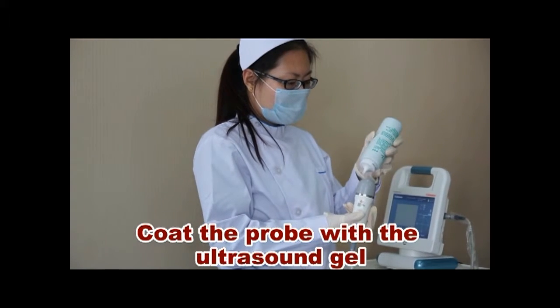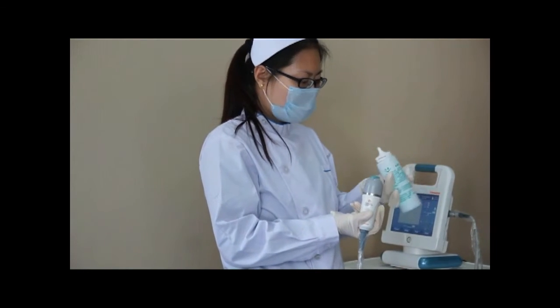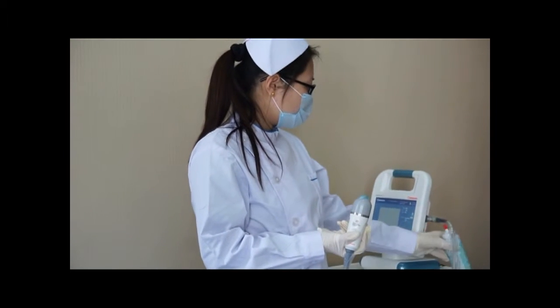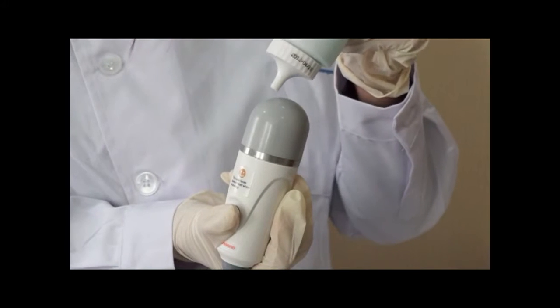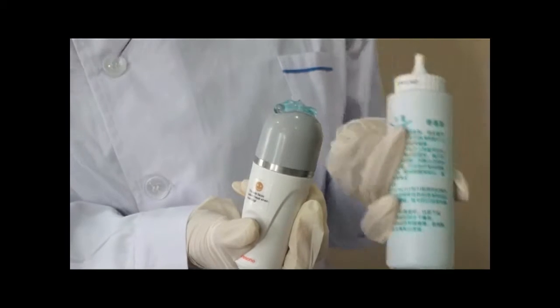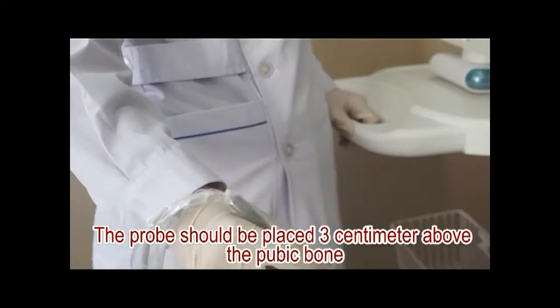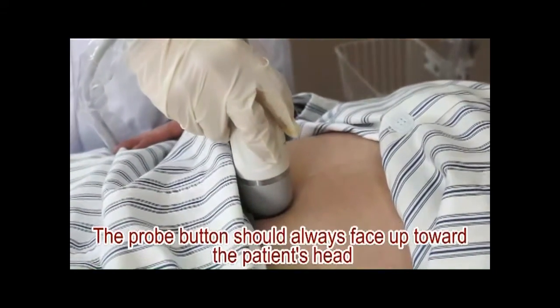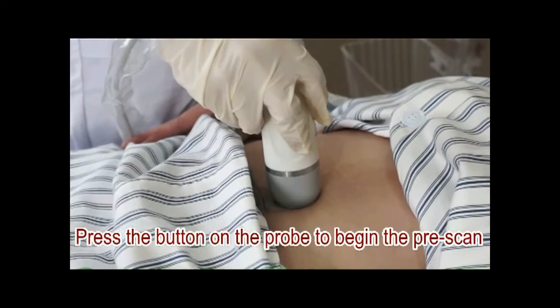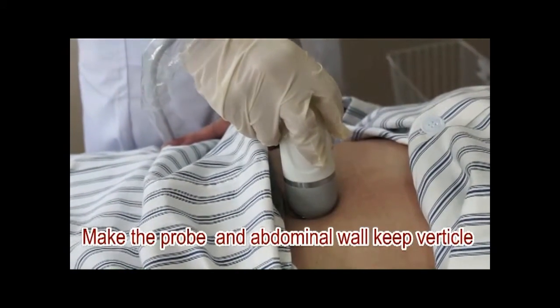Coat the probe with the ultrasound gel. The probe should be placed three centimeters above the pubic bone. The probe button should always face up towards the patient's head. Press the button on the probe to begin the pre-scan. Make the probe and abdominal wall keep vertical.